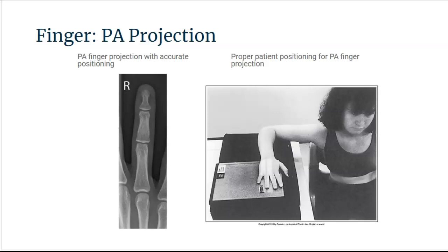The interphalangeal and the metacarpal phalangeal joints are demonstrated as open spaces. The phalanges should be demonstrated without foreshortening. The proximal interphalangeal joint should be demonstrated at the center of the exposure field, and the finger and half of the metacarpal are included within the exposure field.